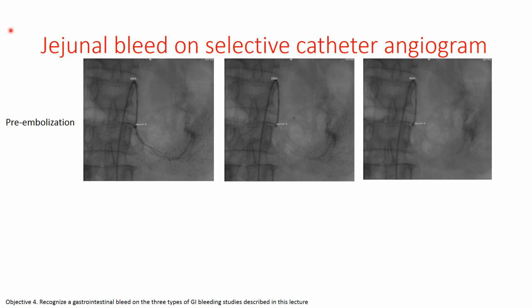Okay, and so this is a jejunal catheterization, jejunal artery catheterization. We see the catheter extending up the aorta into the superior mesenteric artery, and it's now at the branch of one of the jejunal arteries. When we inject contrast, we see contrast within these tubular vessels. They keep branching until they're just kind of string-like or thread-like.